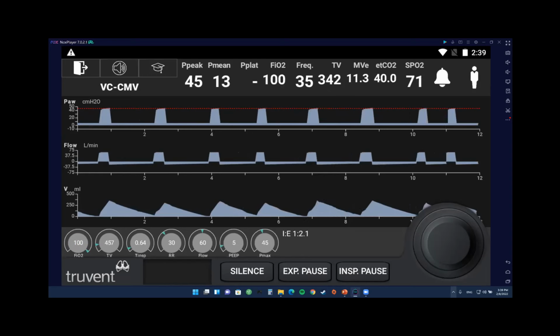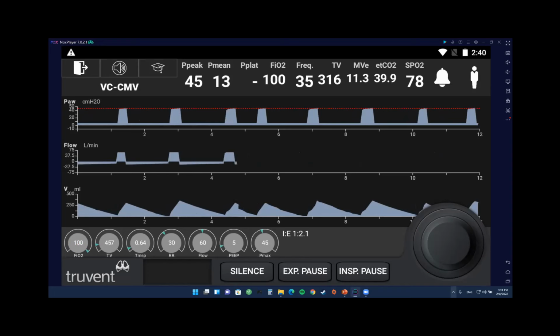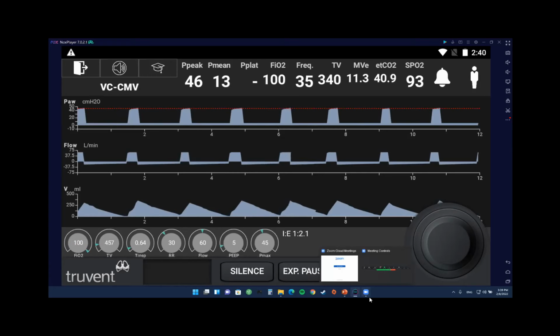Same thing if you are on the floor and a patient is desaturating, you don't start with a nasal cannula going little by little to 4 liters. You grab a non-rebreather and you slap it on the patient. Same principle. Whenever someone is desaturating and crashing in front of you, don't negotiate with oxygen, slap it all the way to the maximum. So now you're giving 100% and the patient sat is going back to 93%.